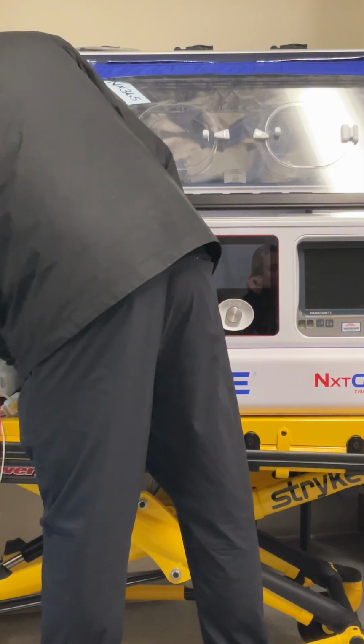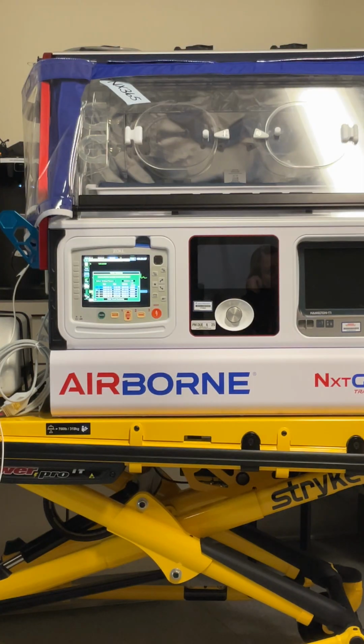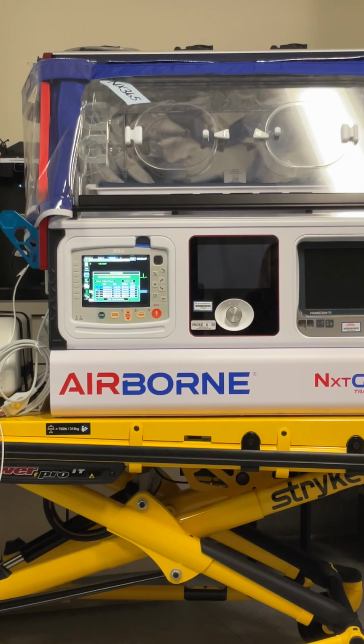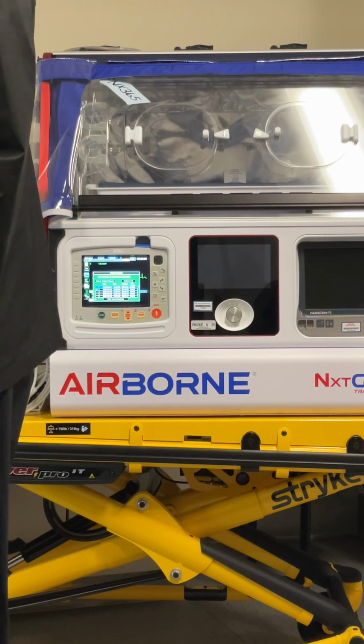Of course, I picked one that has only a little bit of vitals on it, because it's 2 hours. So whatever you had on there would be on that strip. Oh, all of them? Well, there's some there and then there's the bottom here.